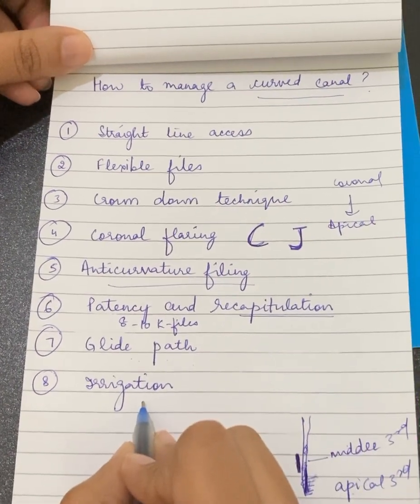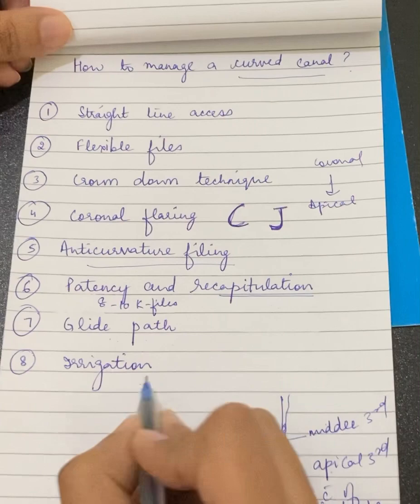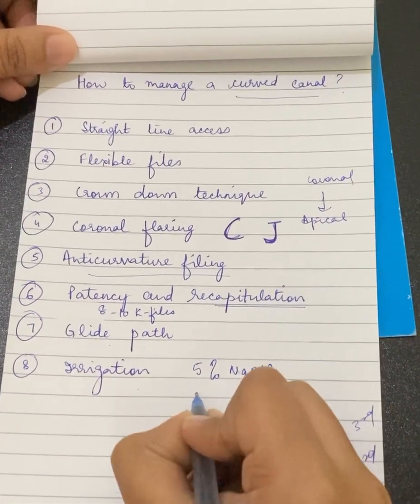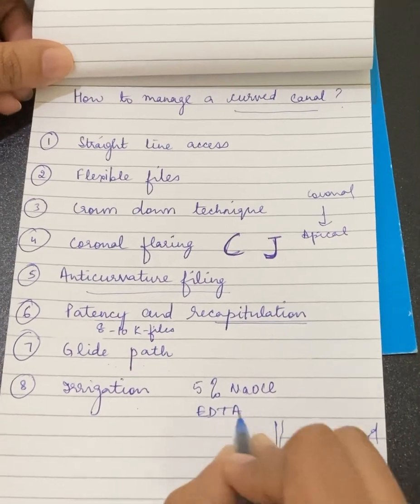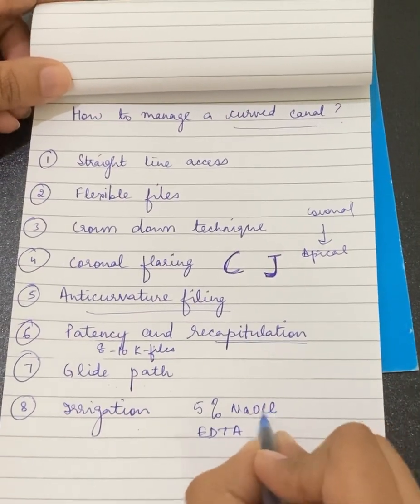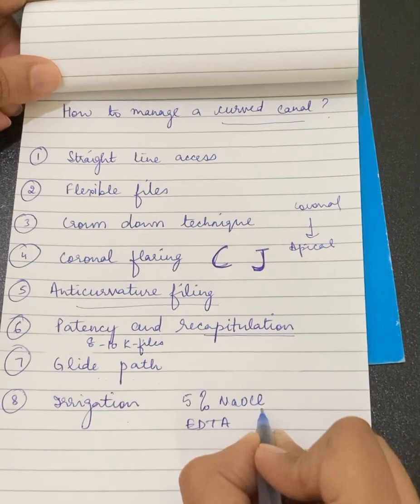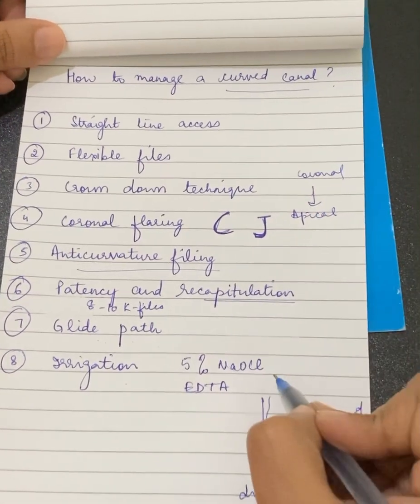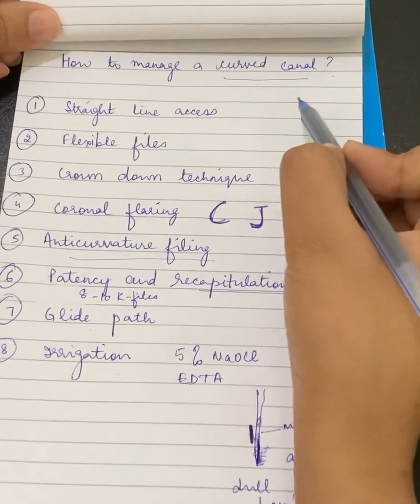Lastly, but very important, is to maintain irrigation. 5% sodium hypochlorite and EDTA should be used again and again. Copious amounts of sodium hypochlorite should be used in order to avoid any kind of canal blockages. So if you follow all these steps, you will be able to manage a curved canal properly.